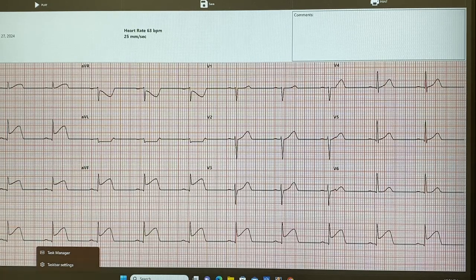If you took a picture of the board, I put the precordial leads on the picture of the heart. You'll see V1, V2, V3, V4, V5, V6. Those are the precordial leads, looking at the heart from different angles. Jessica, V1 and V2, what do they look at? The right ventricle. And V3? V3 is right ventricle still, but from the inferior. V3 and V4 are looking from down below, but V1, V2, V3 are looking at the right side of the heart, which is the right ventricle.